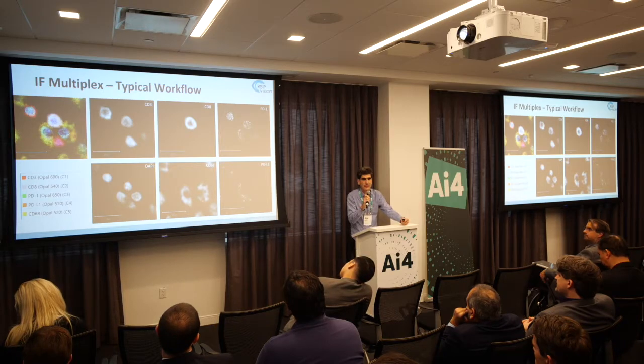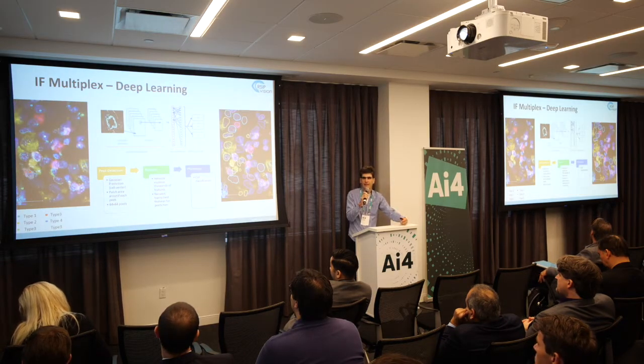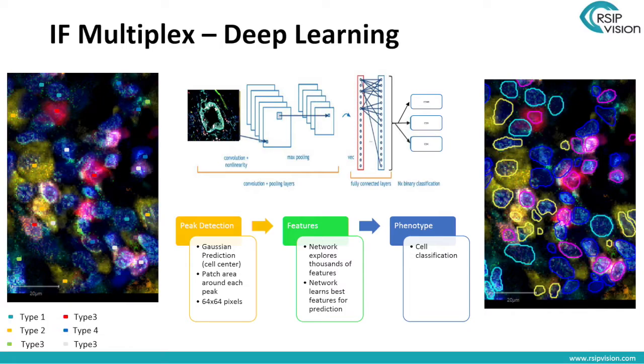And then maybe you'll need an expert to do more of the annotation themselves, clicking on each cell and selecting the proper cell type. Maybe you'll need more extensive training of your annotation team. Maybe you'll have more errors. You'll need to invest more human resources. So always the R&D effort for this type of solution is going to be a combination of the domain knowledge, of manpower that's semi-specialized, like people who have some motivation, some background in biology, but not necessarily pathologists themselves, who are doing most of the legwork for the annotation, and you have an expert supervising it. And, of course, the R&D team who's tweaking the neural networks, retraining, and especially doing failure analysis.